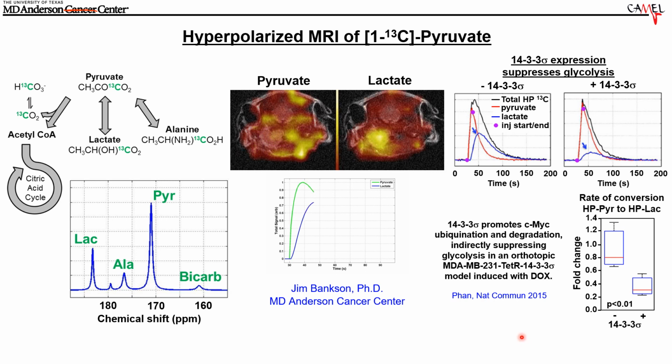So as Jim has shown, and others as well in the field, if you have hyperpolarized C13 pyruvate, it will be converted to lactic acid within tumors. And you really do appreciate this graph showing the increase in pyruvate signal. We'll watch this again. Initial pyruvate burst of signal within the mouse after injecting this material, but then metabolically it's converted to lactic acid pretty quickly, lactate. And so the pyruvate and lactate can be detected separately from the MRI, especially if it's hyperpolarized and has a very large signal.